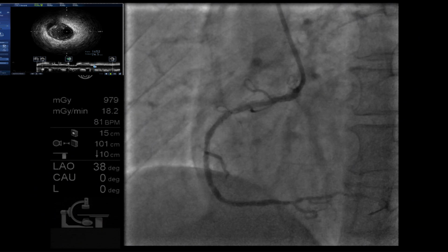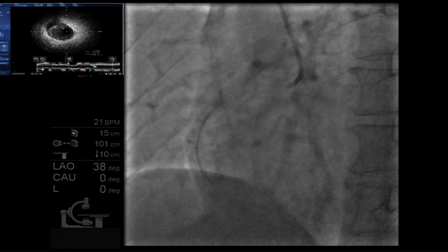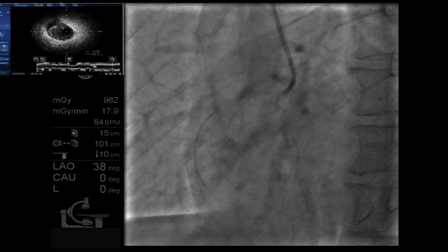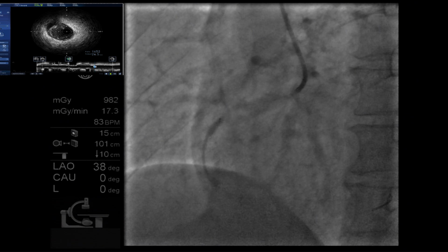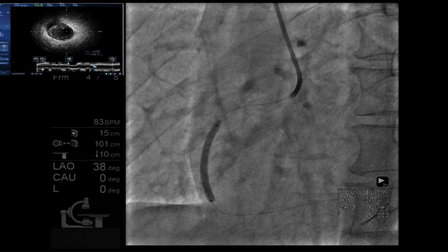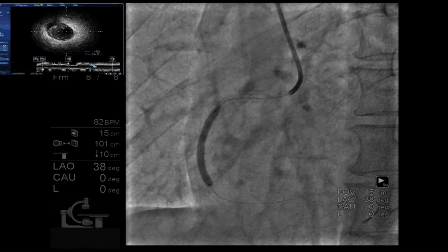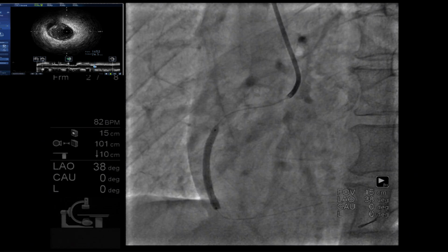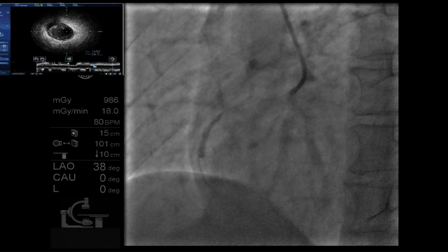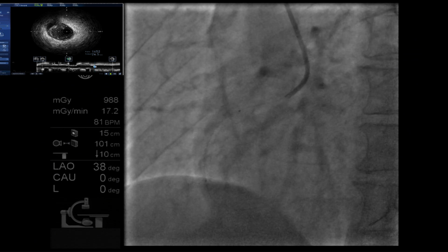It went on just like that. I think it's okay, right? Yes. Okay, go. We need another stent. You make it look so easy, Tak. Let me do a part here. I pull back a little bit. Okay, let's do it here. Go higher.